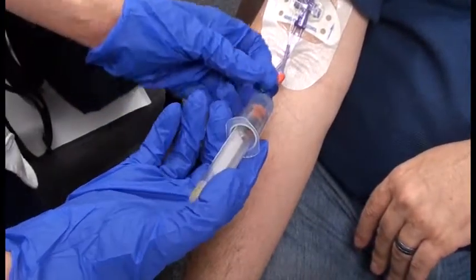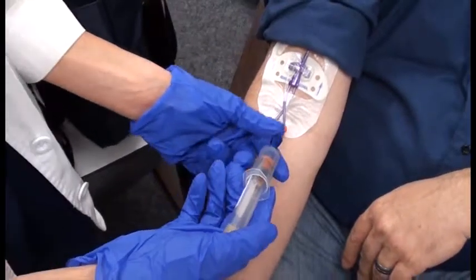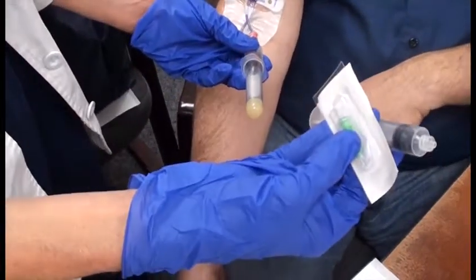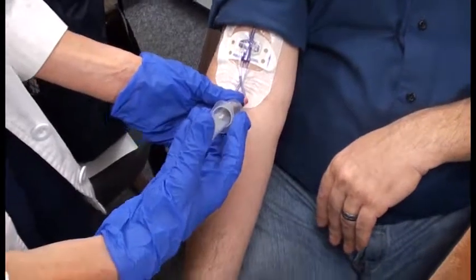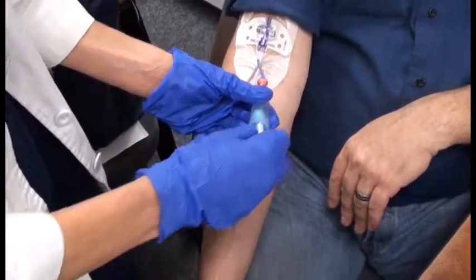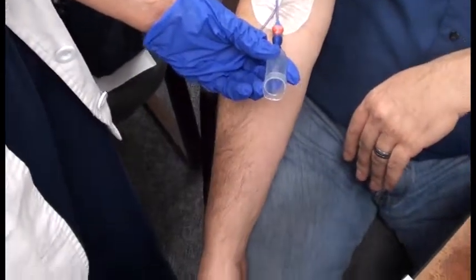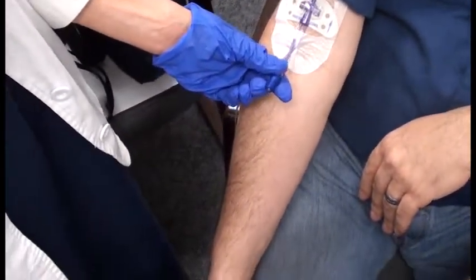This does require a free-flowing line, so if your line is a bit sluggish, this won't work. You will then need to use the syringe and Christmas tree method of drawing multiple labs, but if that's not an issue, you can just fill one lab at a time and simply fill up that way. When you're finished, you would unhook this and then begin your flush procedure.